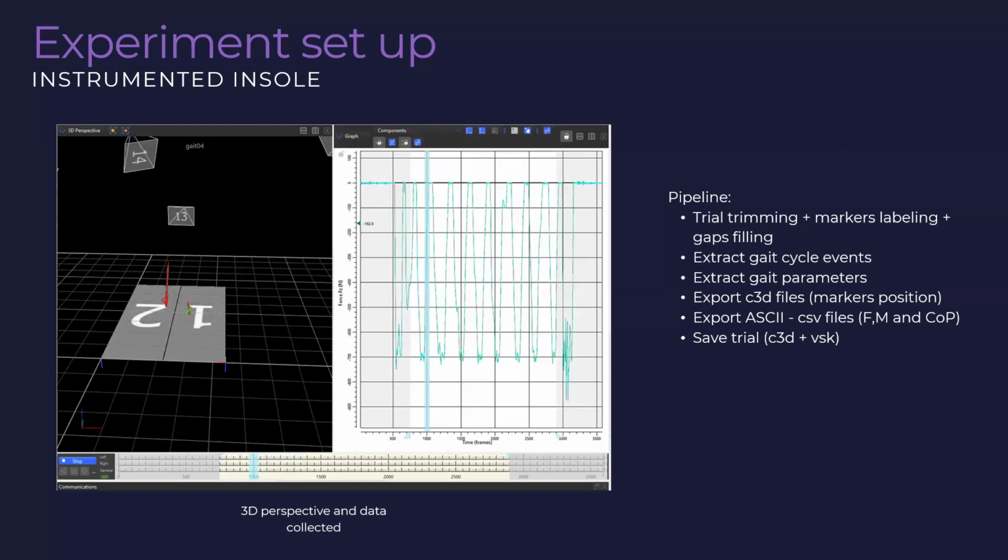And you need markers on very specific anatomical segments and spots. But to extract the different angles, velocity, acceleration, all this information, you need a model, because we need to model the human body to then, based on the position of the markers, have an idea of the angle of the joint, the velocity. So for that, they have created some standardized models, like the Plug-in Gait model.